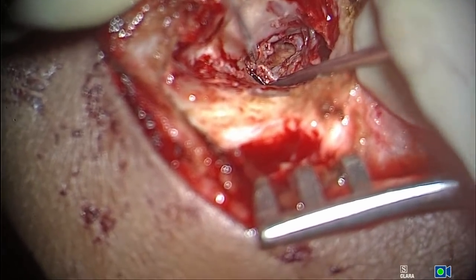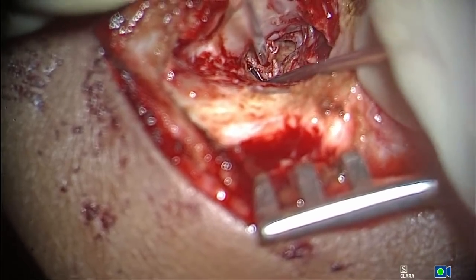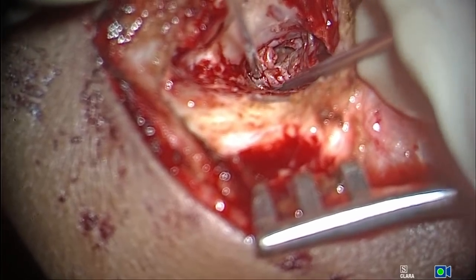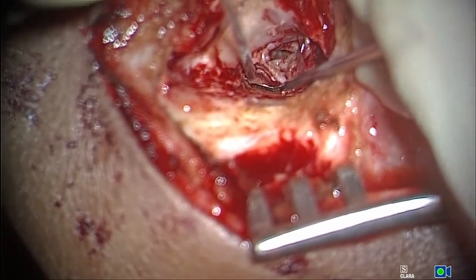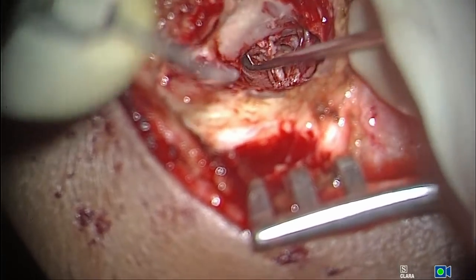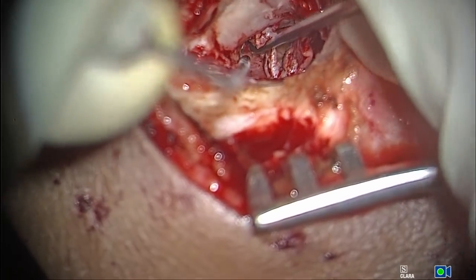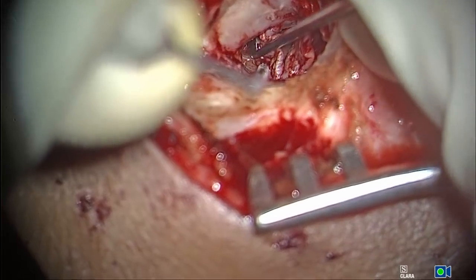To me, I think, please be dexterous while doing surgery. It's not a question of shoving a cartilage or something like that, but the dexterity of the surgery, whatever you do, you should be very, very dexterous. Okay, I'll tell you what. This ventilation pathway, the anterior pathway and the posterior pathway and all the stuff, believe me, all this has come out after the endoscopic ear surgery era. And I will show you now, I don't use endoscopes during my ear surgery.